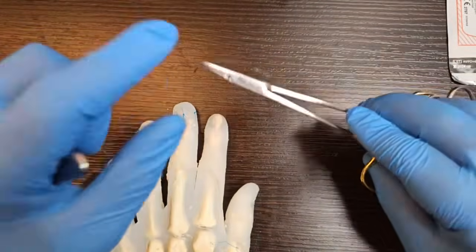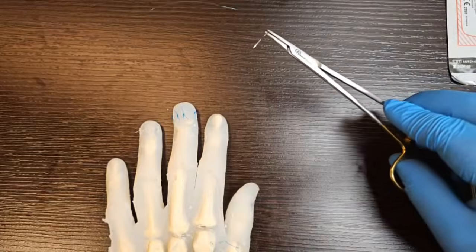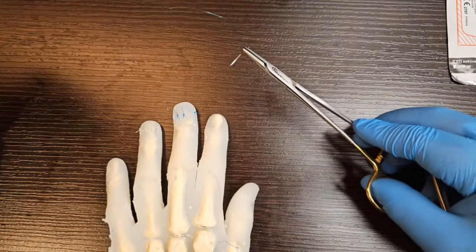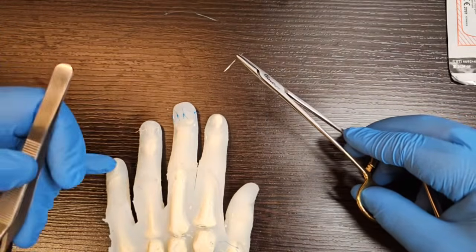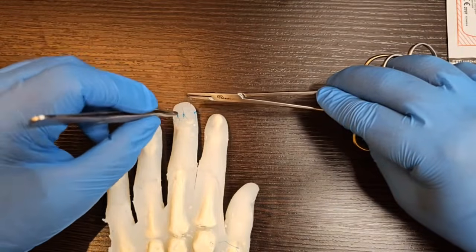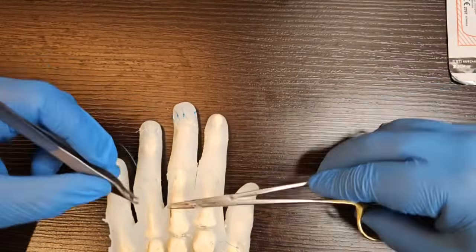In terms of K-wire selection in children, I tend to use a 0.9mm K-wire, or in little fingers of smaller people, maybe under the size of 5 foot in height, because they tend to have quite small, thin little finger bones. In adults, I tend to use a 1 or 1.1mm K-wire in fingertip injuries or phalangeal injuries.